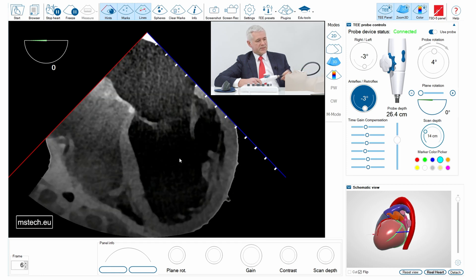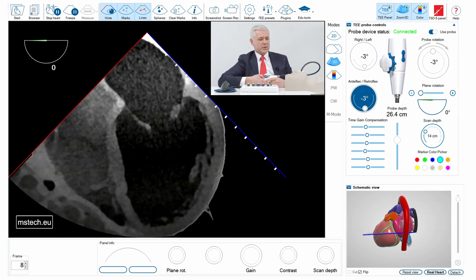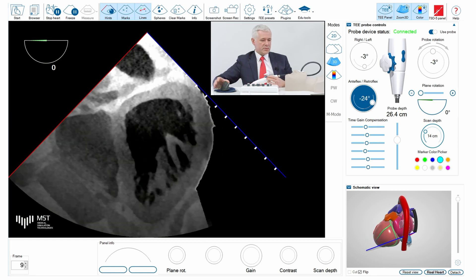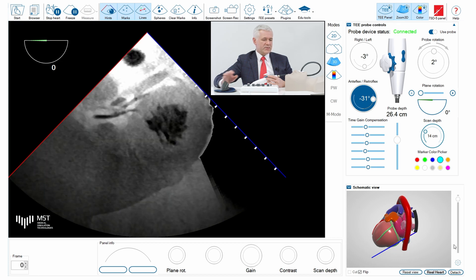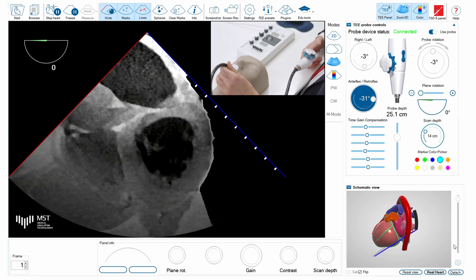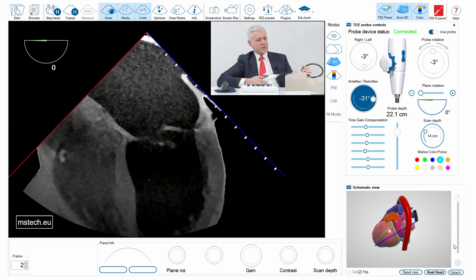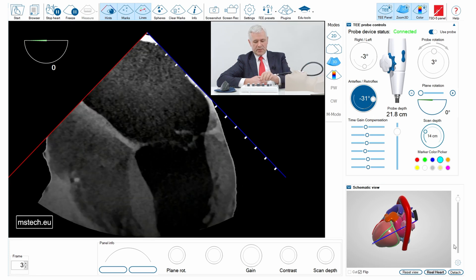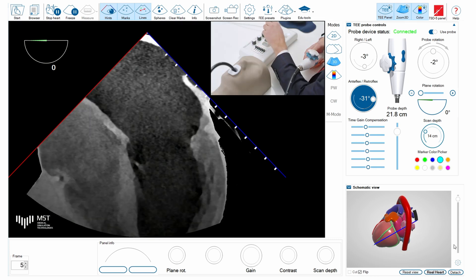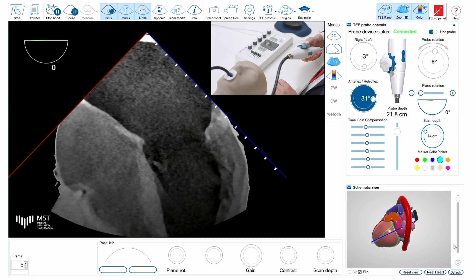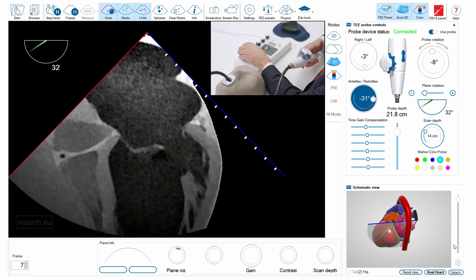To better visualize the valve, I prefer scanning in on-axis views. I will retroflex the plane — you can see on the model the plane going down, becoming more coaxial with the left ventricle which has its apex pointing down. I pull back to obtain the image where the mitral annulus is as large as possible, rotating the probe left and right to center the left ventricle, and then go to the intercommissural view.